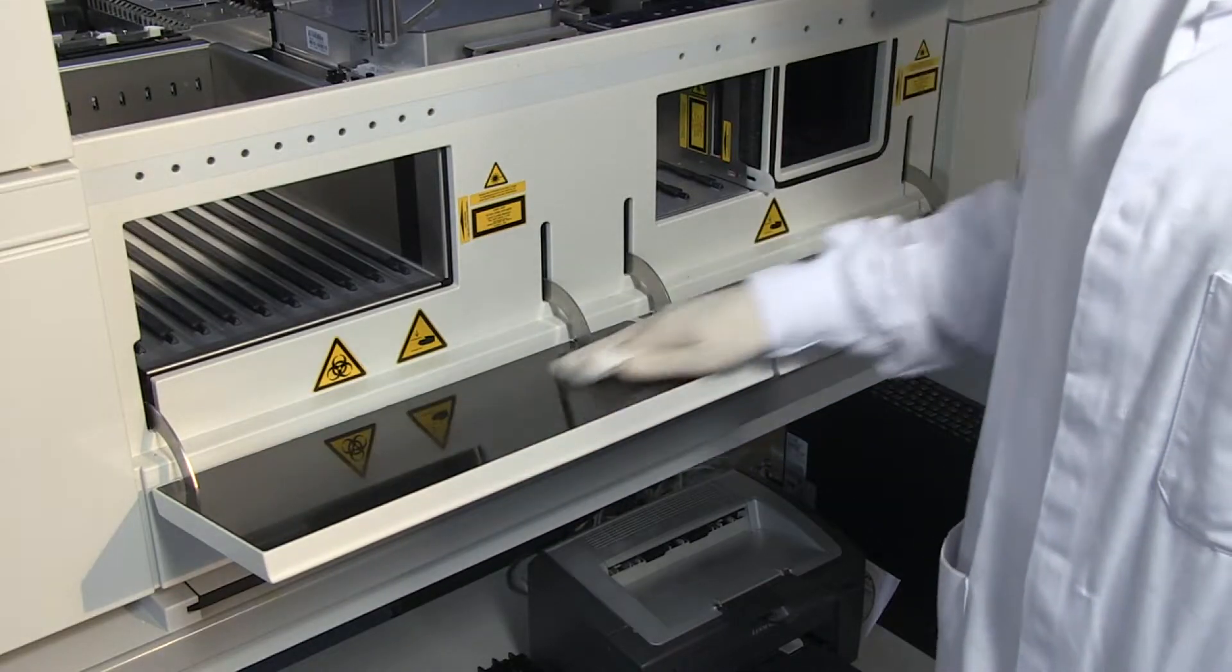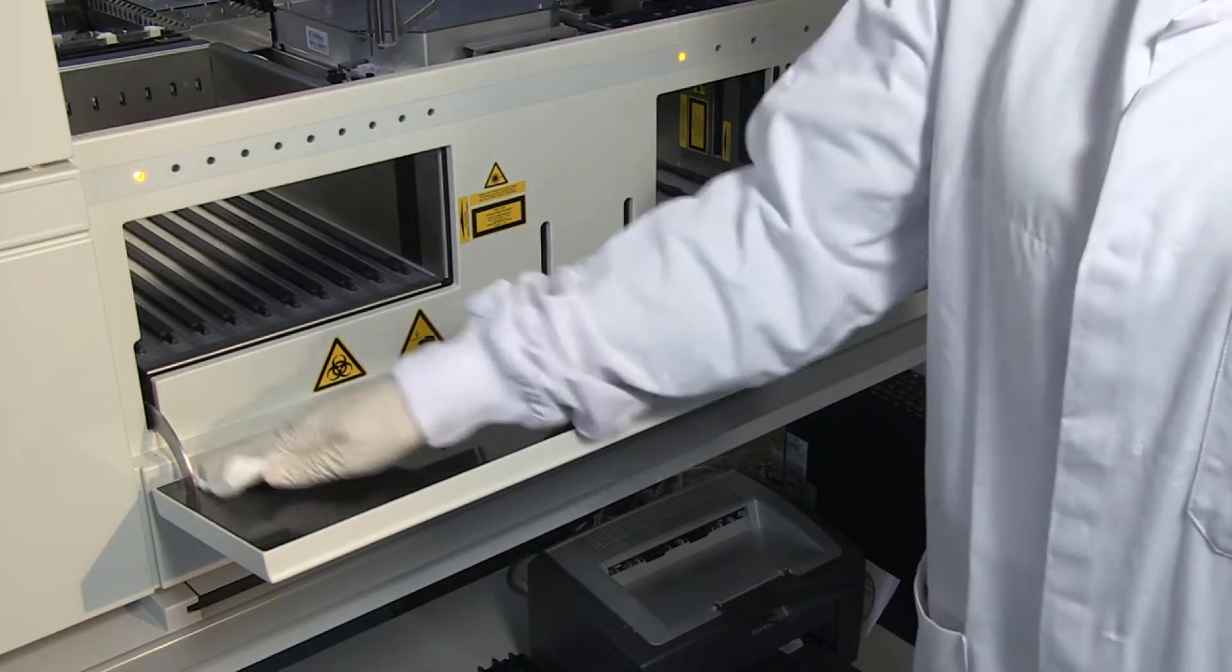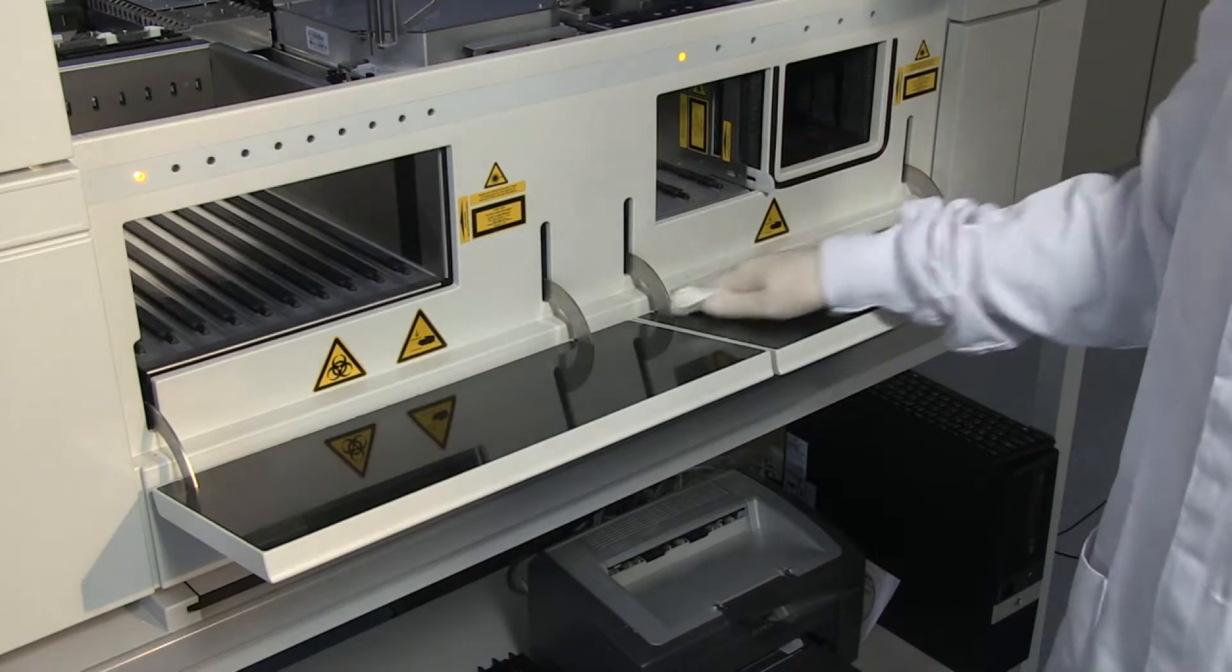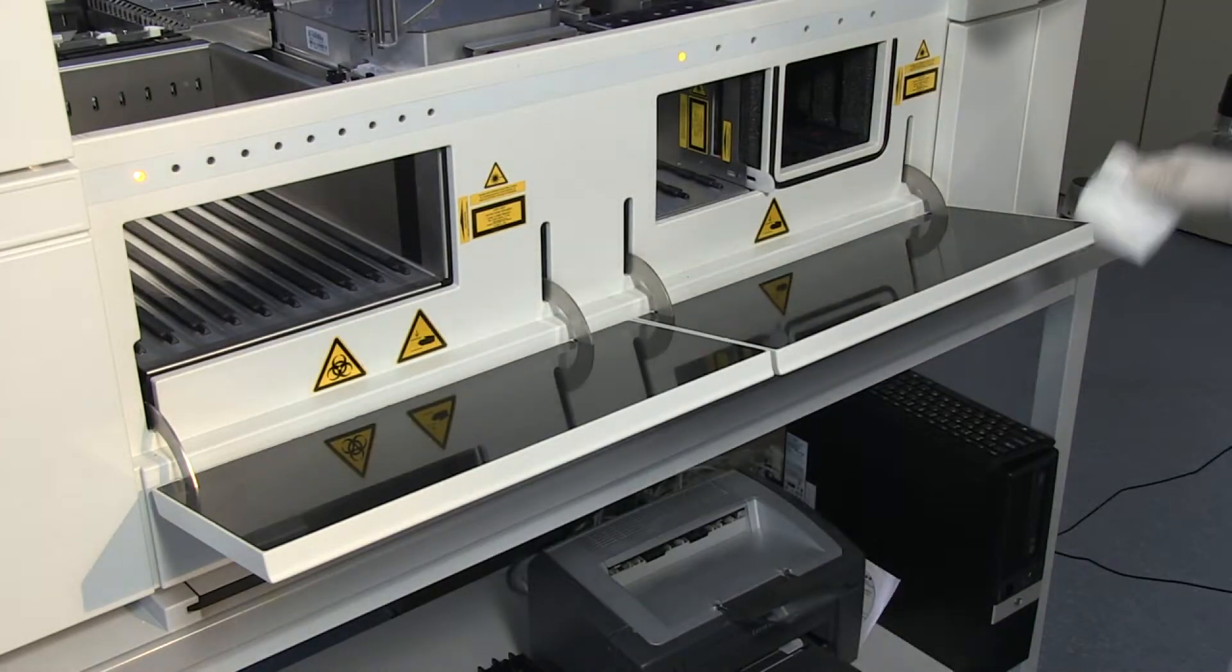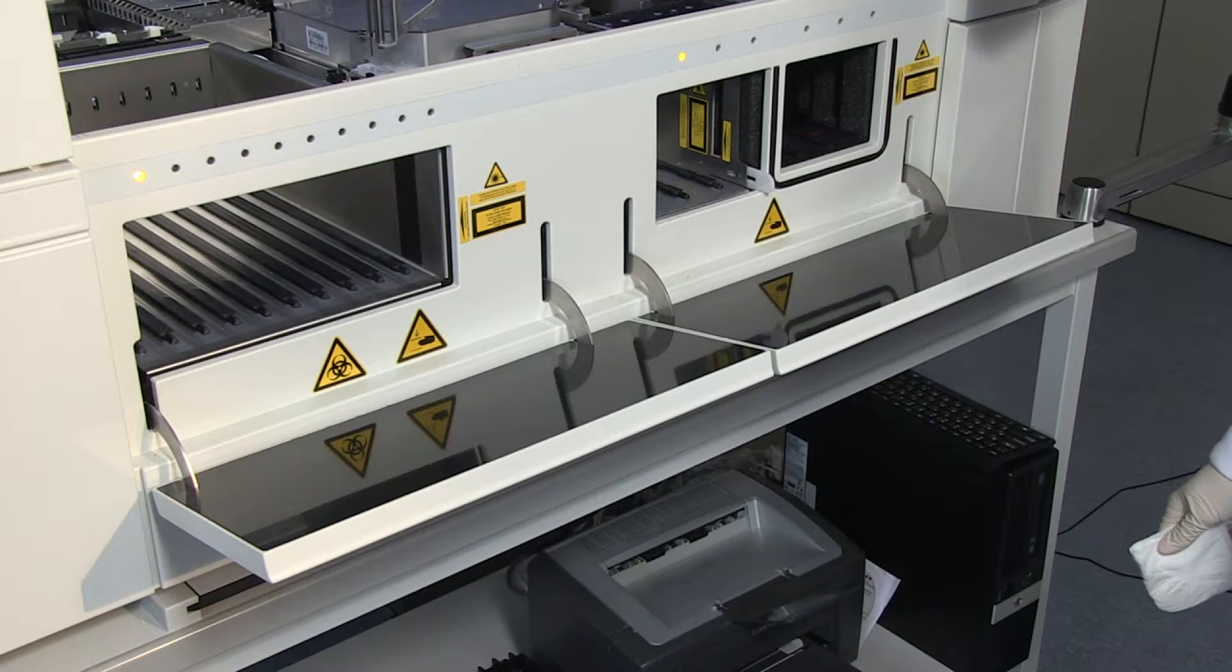Disinfect surfaces with bleach, 0.3% active chlorine, or ethanol 70%. An alcohol-based disinfectant based on ethanol, isopropanol, or n-propanol can be used as well.